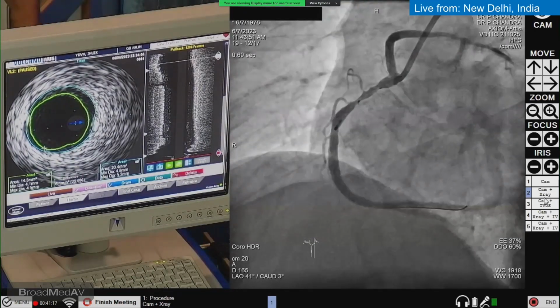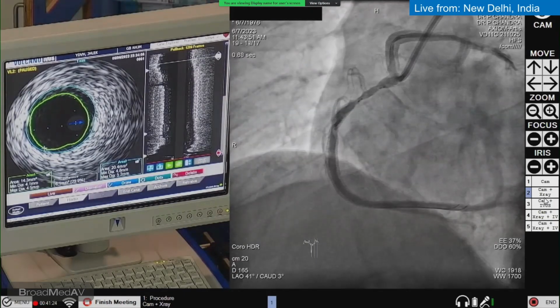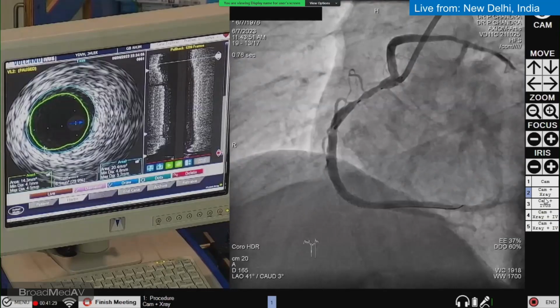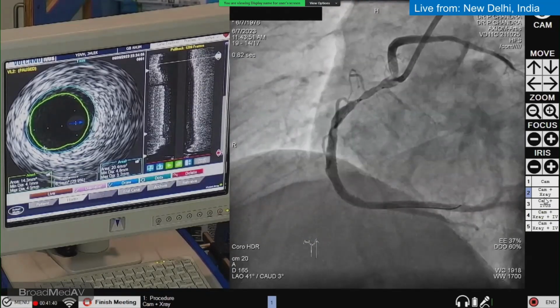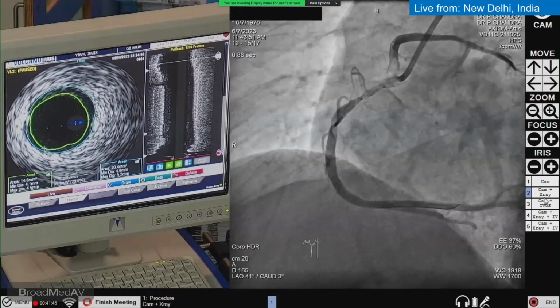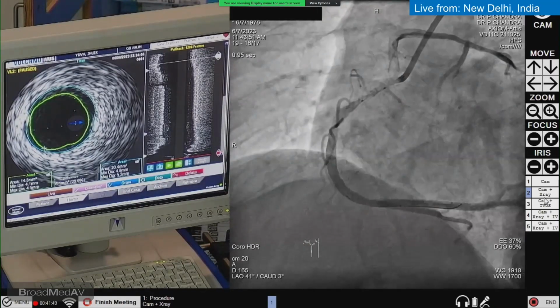So what is your take on this distal lesion? Usually if we don't have IVUS, we would have stented it. But in IVUS, it is very clear. There is hardly any plaque there. It's just the size of the vessel, maybe because of the ectasia. So this is a normal segment. We don't need to cover that. This is how imaging is. Yeah, imaging is very important. Although it looks very simple. But yeah, give me this one. So we are taking a DES Angiolite 4.5 into 19.